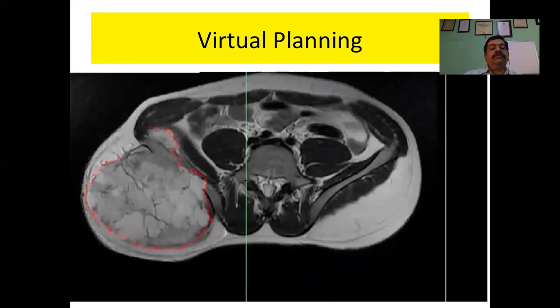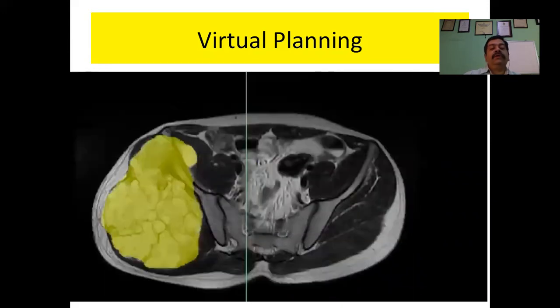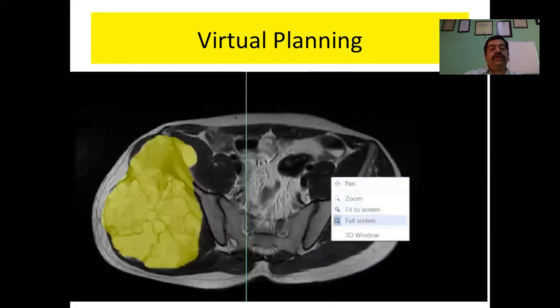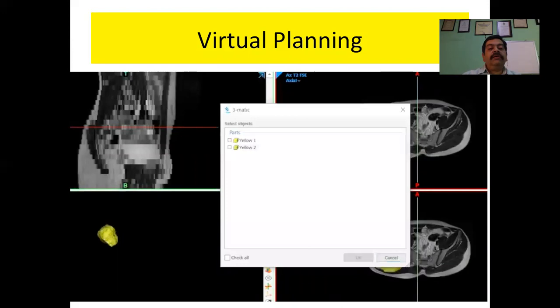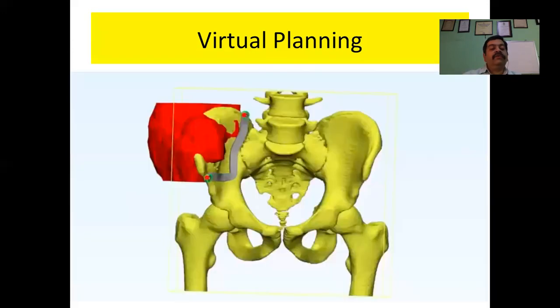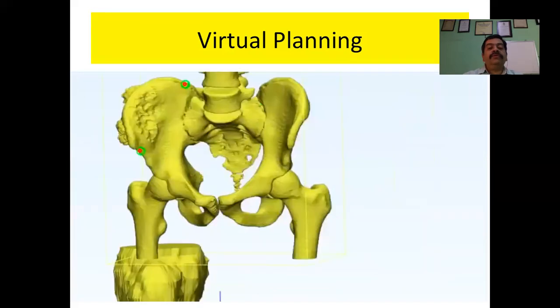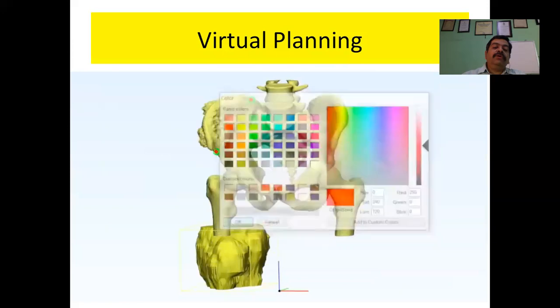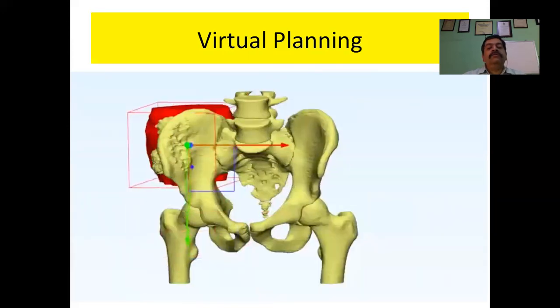We are marking the tumor, taking the soft tissue component from the MRI, extracting it and transferring it into a software where you can fuse both the CT and the MRI. So the possibilities are immense. You can fuse MR with PET CTs, you can fuse PET CTs with CT scans, and then you can have your absolutely accurate 3D model on which you can do your virtual planning as well as surgery preoperatively.